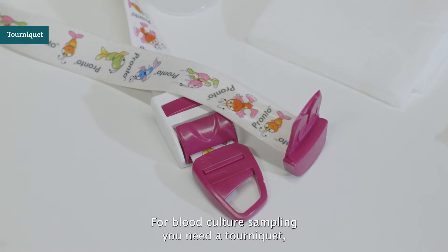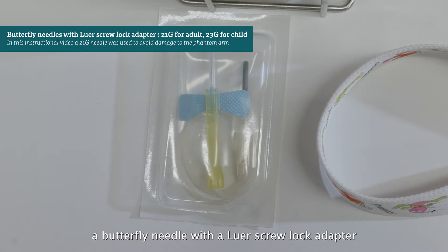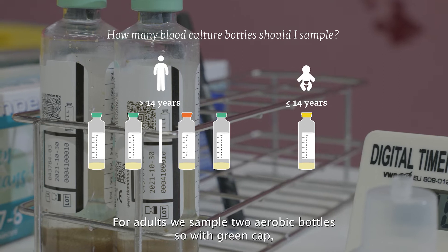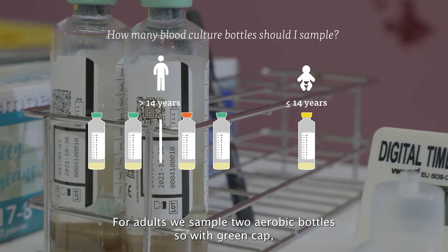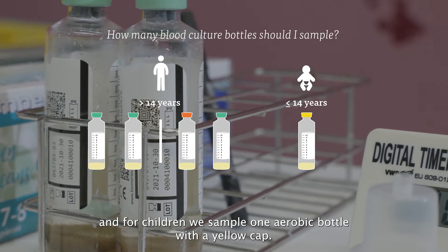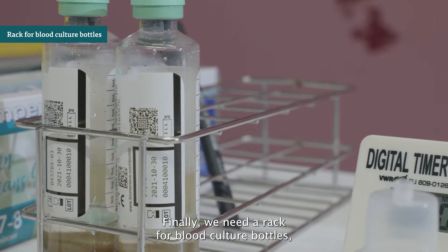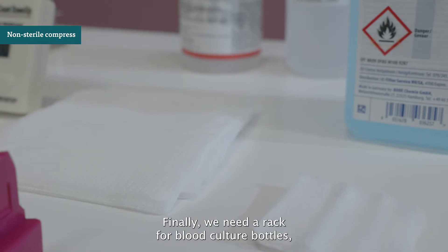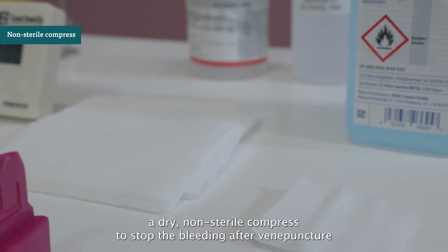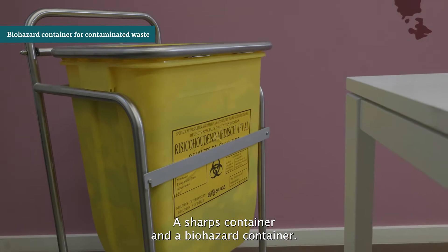For blood culture sampling, you need a tourniquet, a butterfly needle with luer screw lock adapter, and a blood culture holder. For adults, we sample 2 aerobic bottles with green caps. For children, we sample 1 aerobic bottle with a yellow cap. Finally, we need a rack for blood culture bottles, a dry non-sterile compress to stop bleeding after venipuncture, a bandage, a sharps container, and a biohazard container.